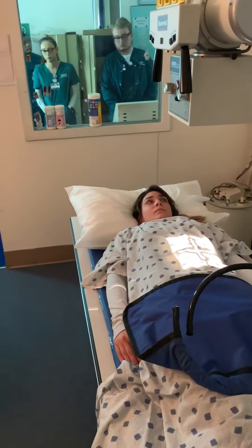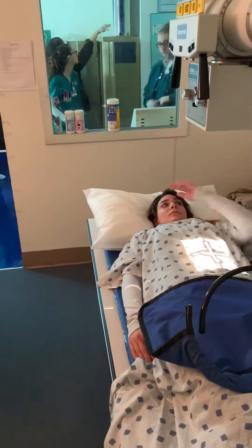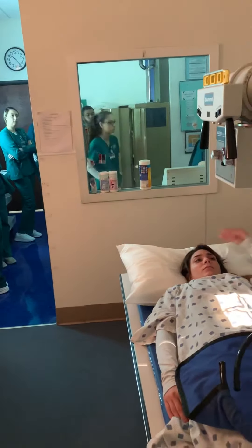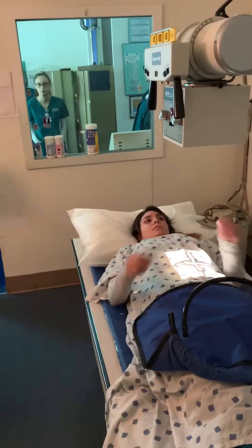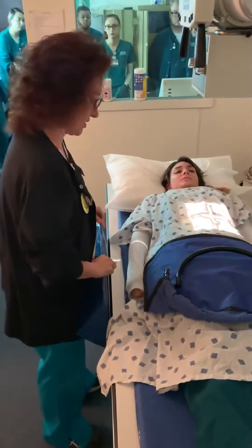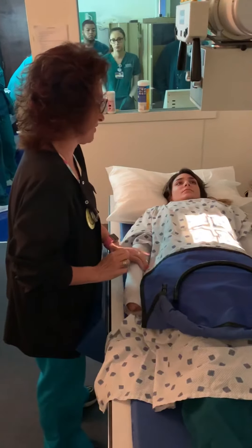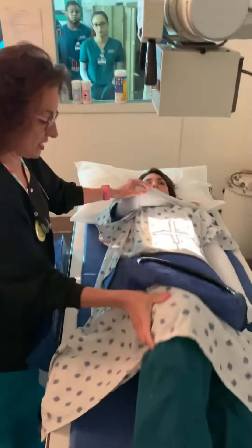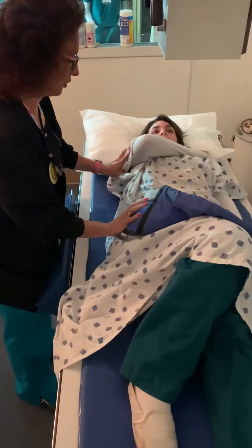I want you to pay attention to how I get her in position. So what you're going to tell your patient to do when you want them to roll — I'm going to tell her: Charlie, I want you to bring your right arm over to your left shoulder. I want you to bend your right knee. And then I just want you to roll away from me.